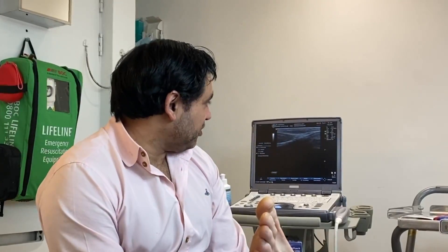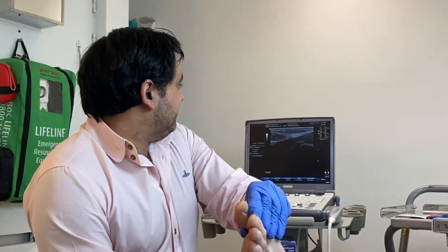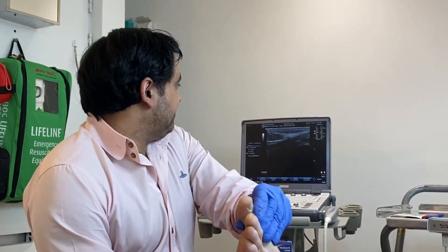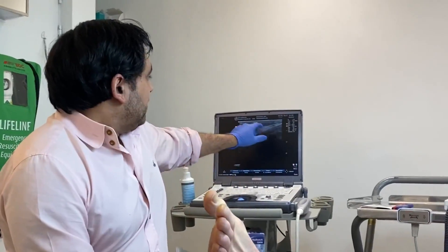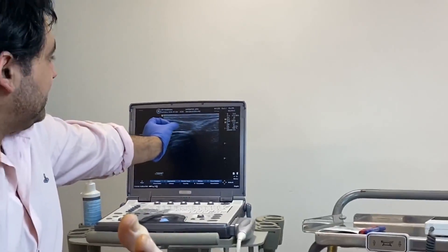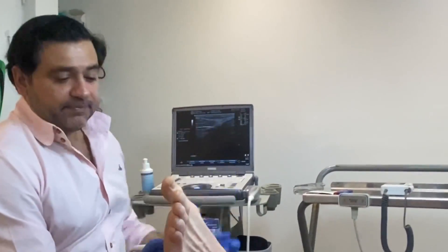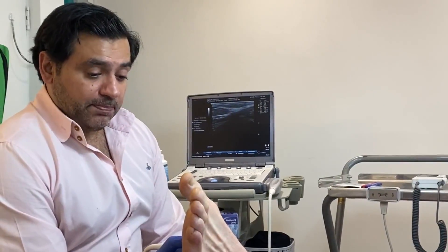Unfortunately, he's had it for many years — about six years — so quite some time. I'm hoping it's not going to affect things. Right underneath there you'll see the flexor hallucis longus tendon, which is moving quite well. The abductor hallucis muscle belly has also been impacted by the fibroma — it's actually impinging on the abductor hallucis muscle belly.